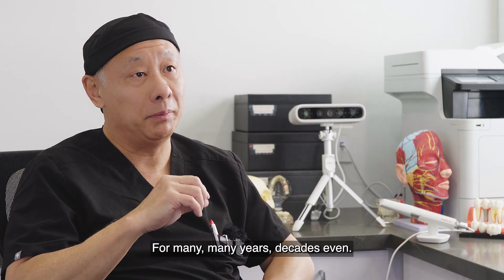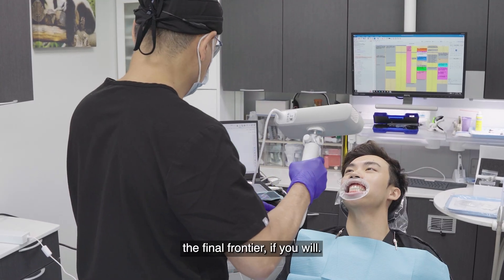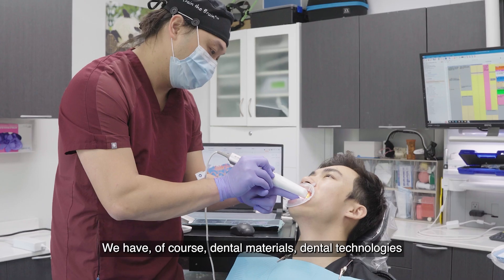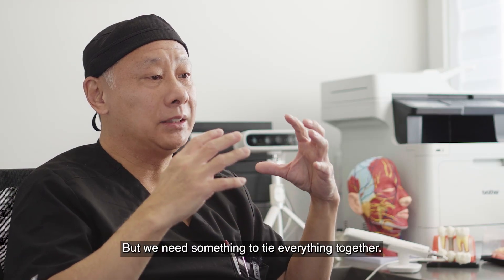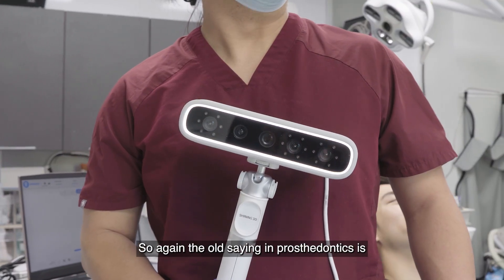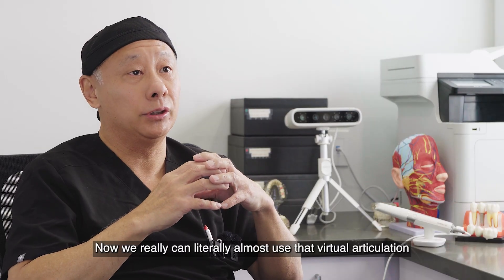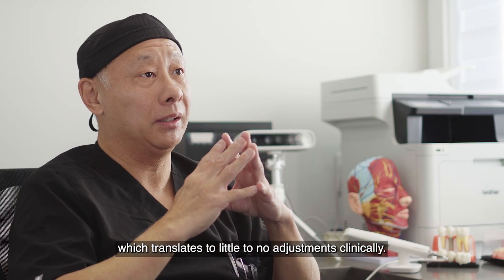This is the missing link for many, many years — decades. I think MetaSmile really is the final frontier, if you will. We certainly have a lot of diagnostics and cone beams, intraoral scanners, dental materials, and dental technologies that have their own functionalities and uses. But we need something to tie everything together, and that is the patient's articulation. The old saying in prosthodontics is the best articulator is the patient's head. Now we can literally use that virtual articulation and do as much work as we can on the benchtop, which translates to little to no adjustments clinically.